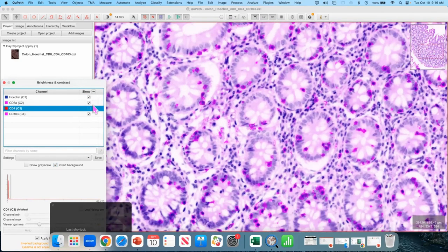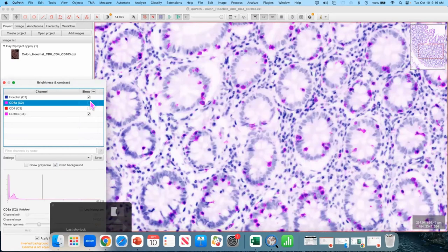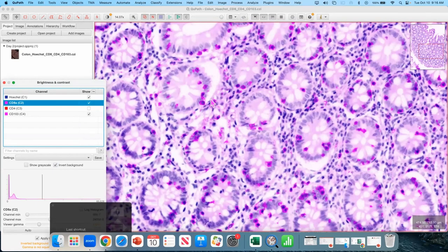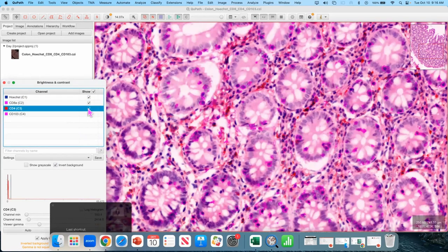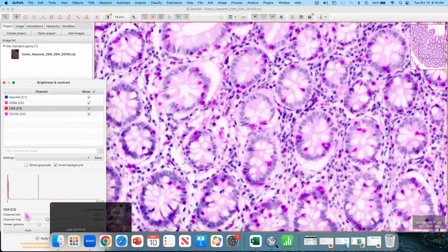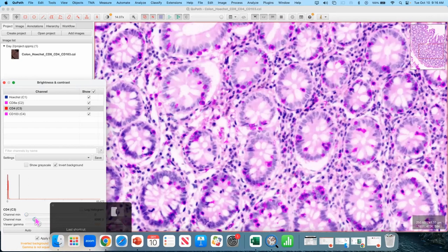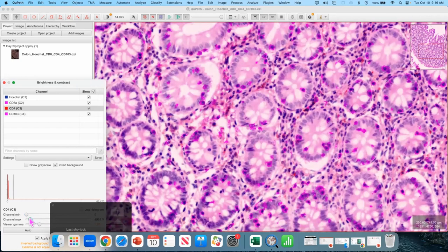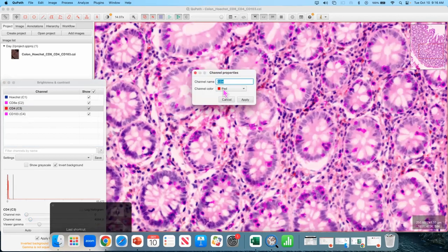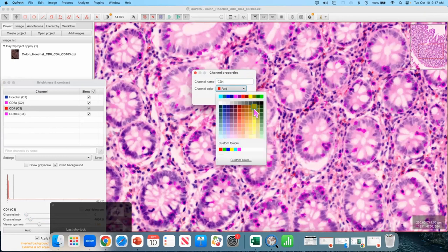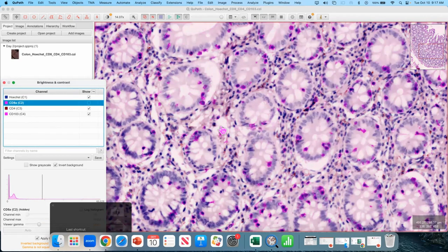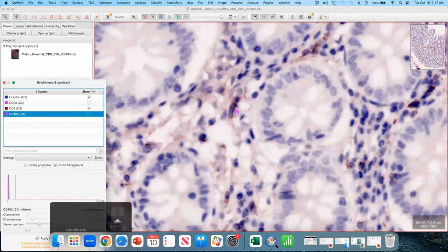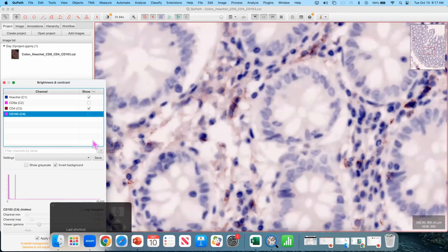And actually, if you want to, the thing that I know it didn't come across necessarily in the slide yesterday, but what Zee was kind of shown, here it happens that some cells are stained in green, so that's why they're sort of dark pink. But the other thing is, like, say, for example, here are the CD4 T-cells, right? And I think we can play with that a little bit. But I think you can see where this is going. If we take those CD4 T-cells and assign them to a brownish color, and we remove our eosin, then in a sense you're getting almost like a DAB stain, right? And this can be optimized, but so cool, right?